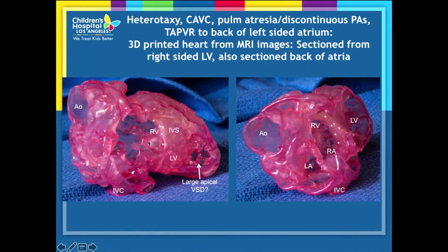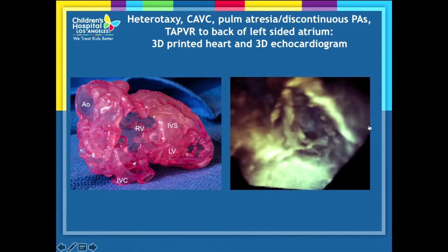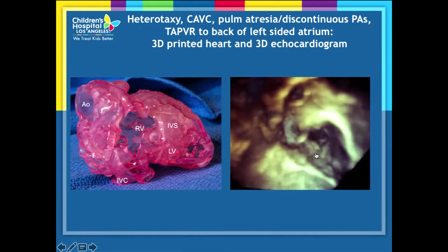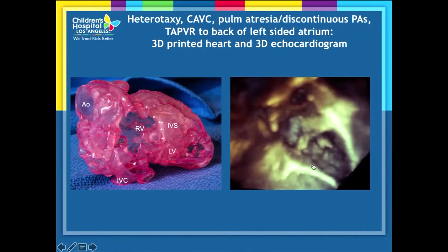But again, the thing that is hard to tell here, and I apologize, this is still a 2D image. It's better if you actually held it in your hand. But it's kind of hard to tell exactly where the AV valve is. So what I tried to do is crop it the same way that you did with this over here, so you can see. And here's the AV valve tissue over here. This is that crest of the septum as we're looking at it over here. And you can see a little bit better how the AV valves really play an integral role in the whole decision making process of this particular patient.